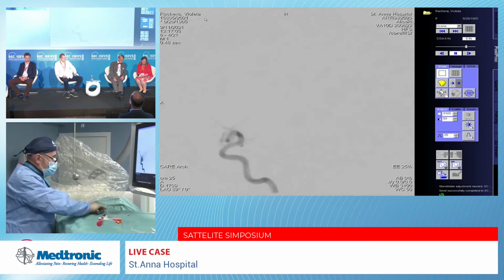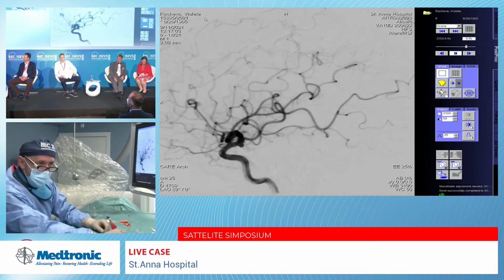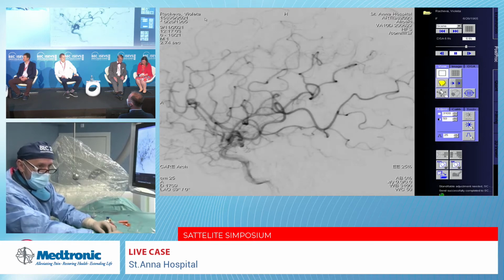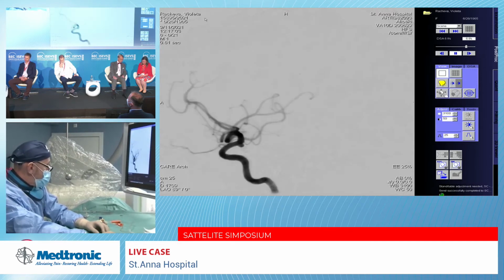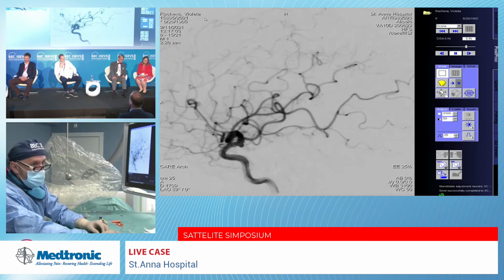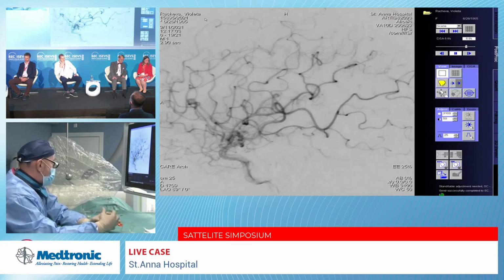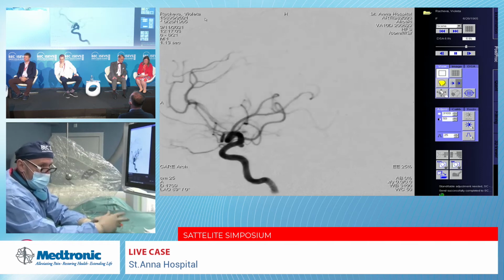Yes. In this context, as an ignorant cardiologist, I wanted to ask you regarding the antiplatelet treatment. We have two controversial targets: to keep patency of the stent, of the flow diverter, and to have thrombosis of the aneurysm. What is the regimen of antiplatelet in this situation? Because it's a matter of brain, of course, we want to see patency in the parent vessel. Okay, so what is the regimen?